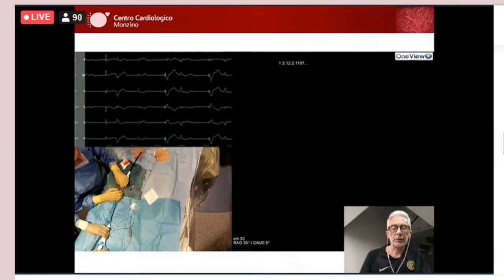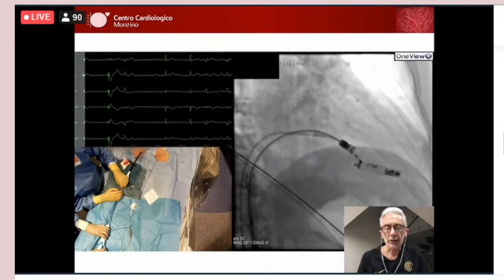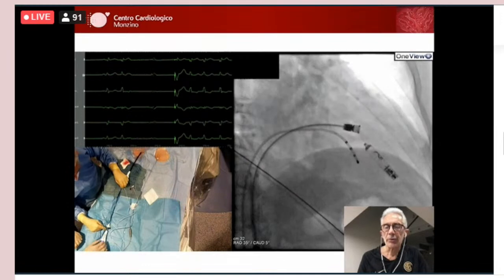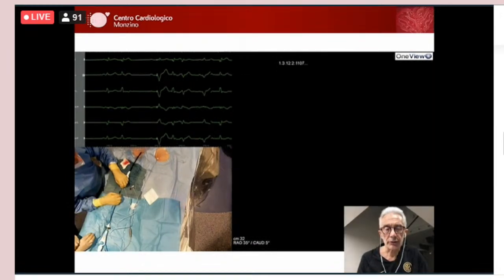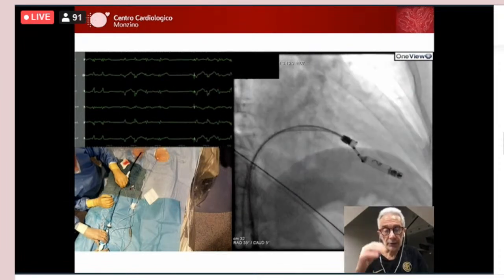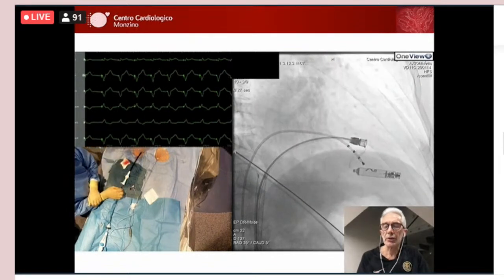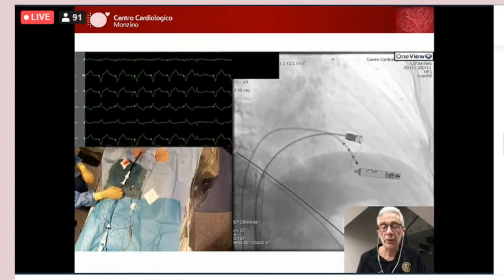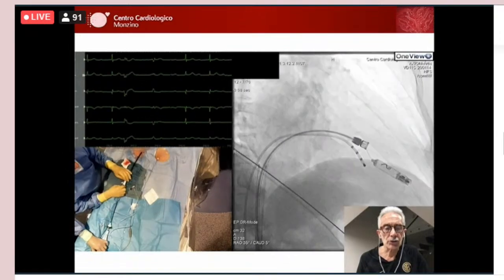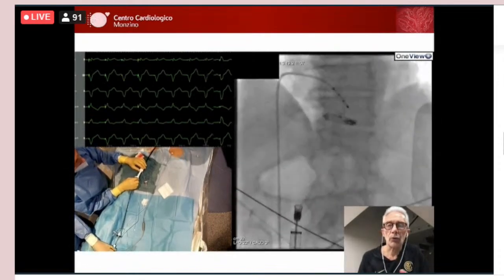So this is a portion of the procedure in which you need to deflect the assembly to move back and forth, up and down the device, just to make sure that the device itself is really attached to the myocardium. And then you proceed to test the biophysical parameters, the pacing threshold, the impedance, and the sensing as well. So once we are happy with the position and with the parameters, you can appreciate at the upper left end of the slide, and then we can proceed and finally detach the device and complete the first portion of the procedure.